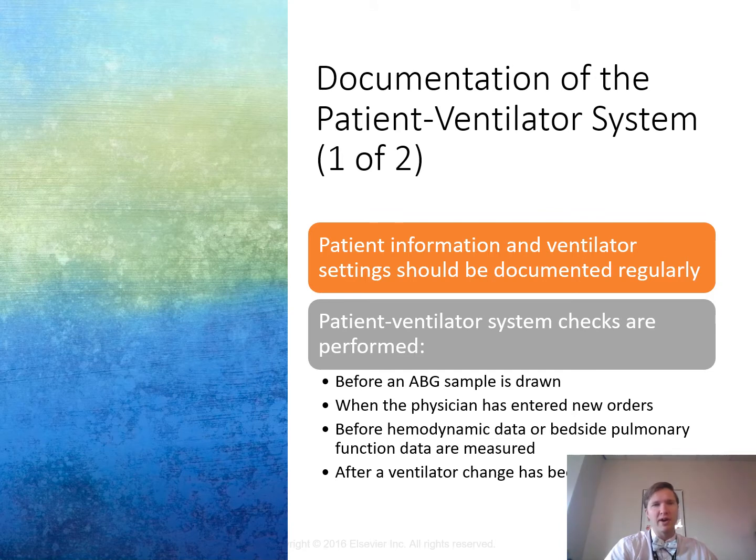One more note real quick about the physician's order for the vent settings. Every once in a while, could someone change a vent setting and not know it? Absolutely. So if something's changed, we need to note that and understand who did it, right? And sometimes they just didn't update the order. That order needs to be updated, but that's going to be helpful as well. But that narrative of clinical observations at the time of the check is going to be important to making sure that the ventilator assessment includes a picture of what the patient looked like when you went in to see him.